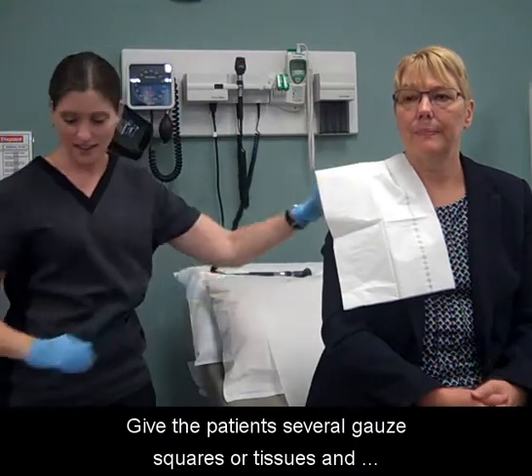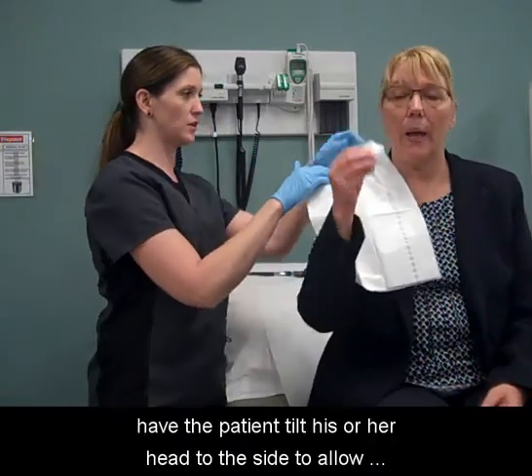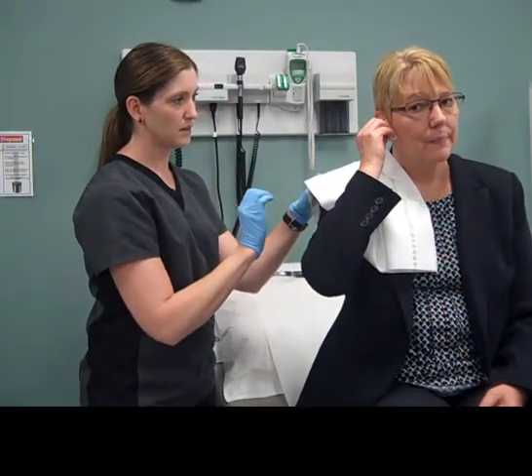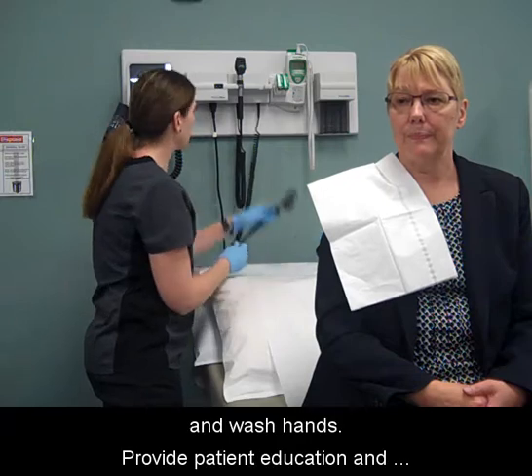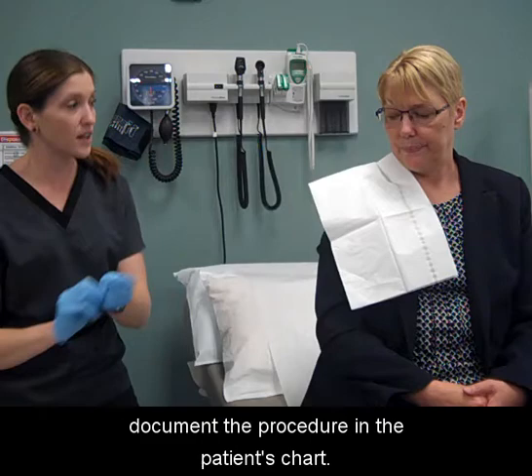Give the patient several gauze squares or tissues and have the patient tilt his or her head to the side to allow drainage of excess solution from the canal. Dispose of material, remove gloves, and wash hands. Provide patient education and document the procedure in the patient's chart.